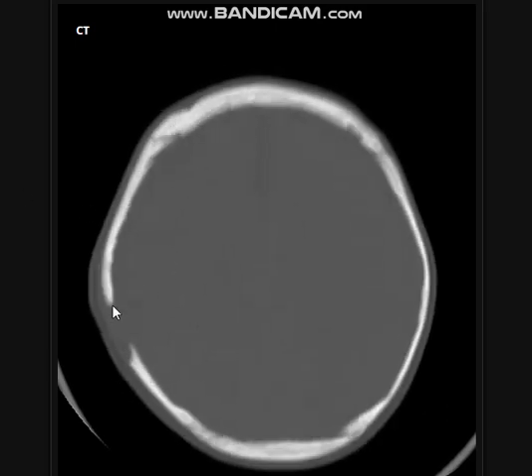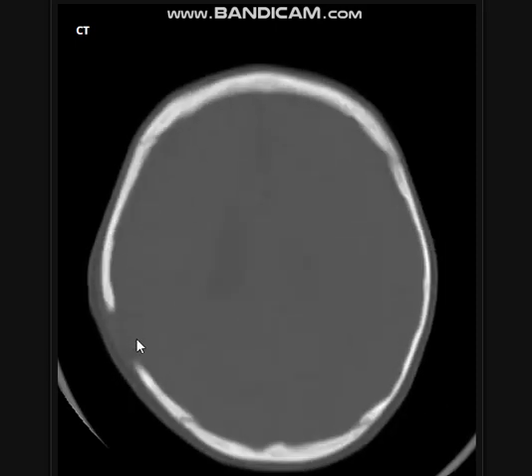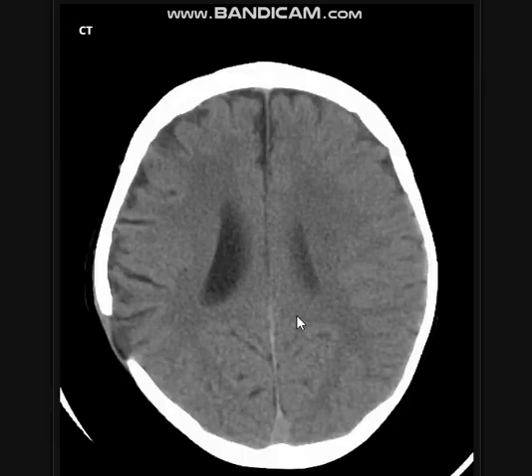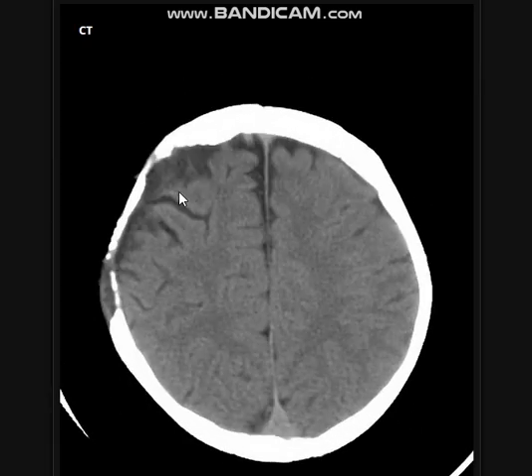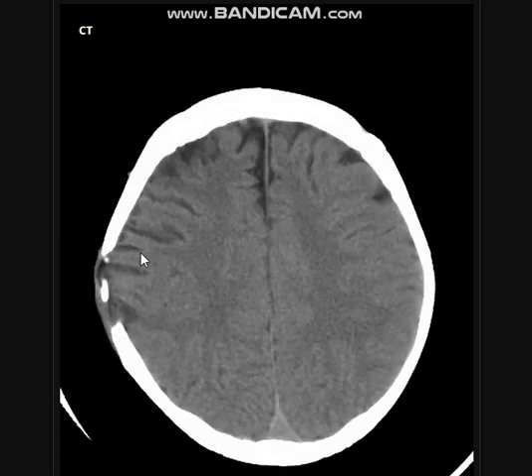When we examine the brain window, you can see right frontal areas of encephalomalacia, which are likely sequelae of cerebral contusions secondary to the trauma.